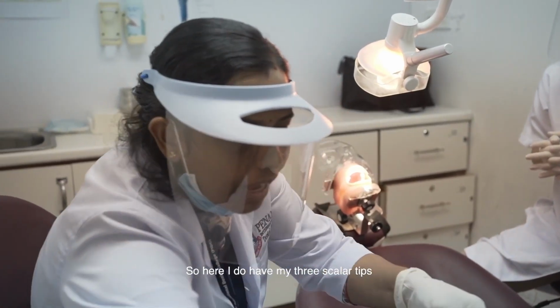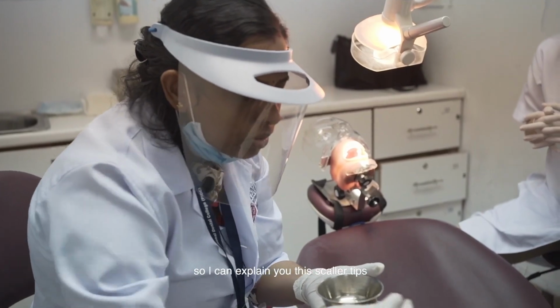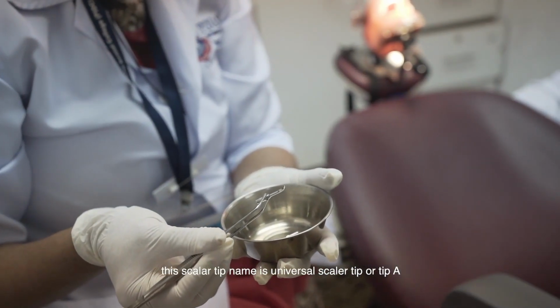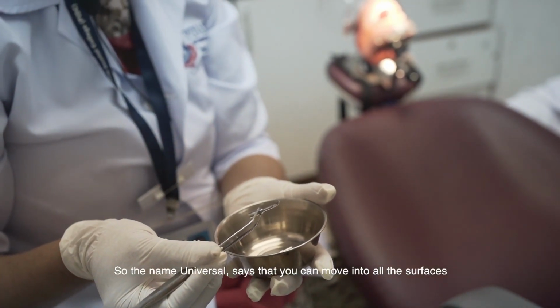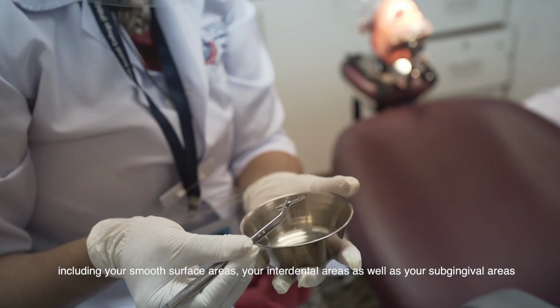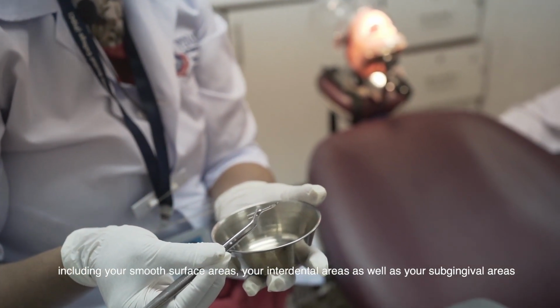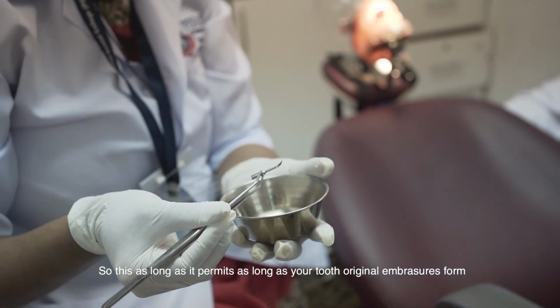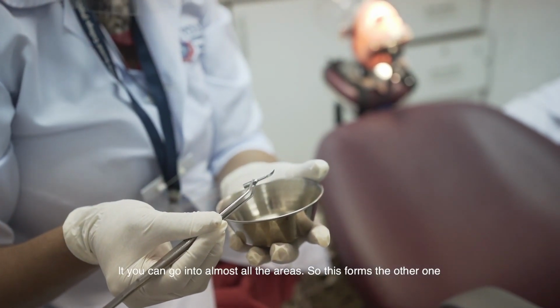Here I have my 3 scaler tips, so I can explain the scaler tips. This scaler tip is the universal scaler tip, or tip A. The name universal itself says that you can move into all the surfaces, including your smooth surface areas, your interdental areas as well as your subgingival areas, as long as your tooth or gingival embrasures permit, you can go into almost all the areas.